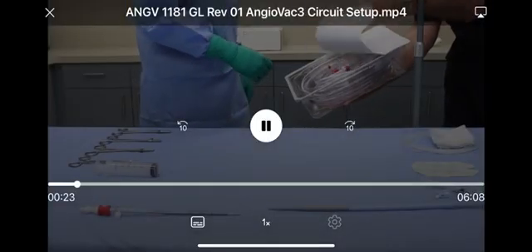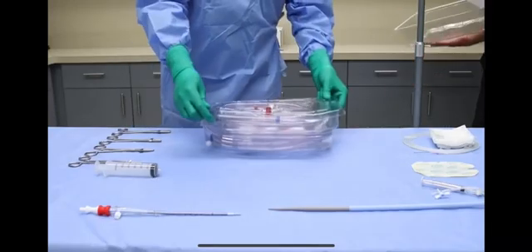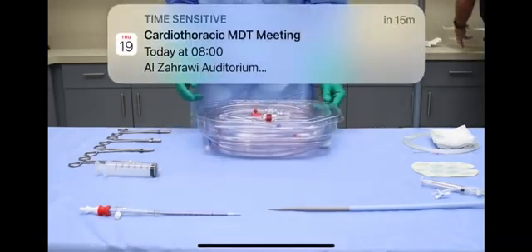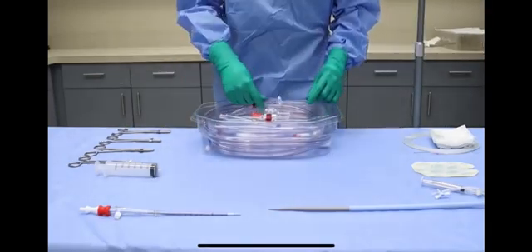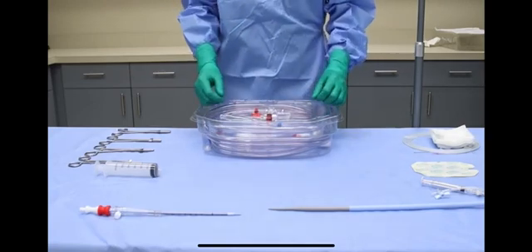Open the packaging using sterile technique. Remove the inner tray assembly and place it on the sterile field. Visually inspect the circuit for defects and ensure that all protective end caps are in place.